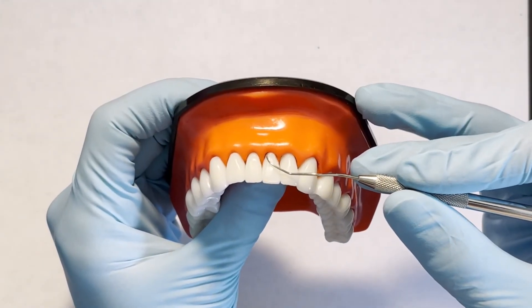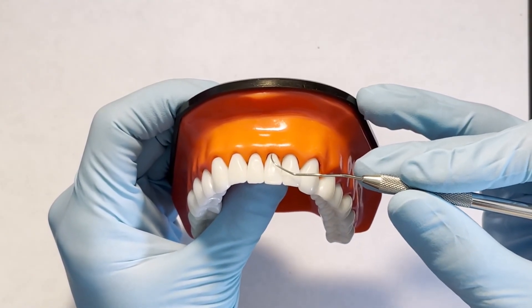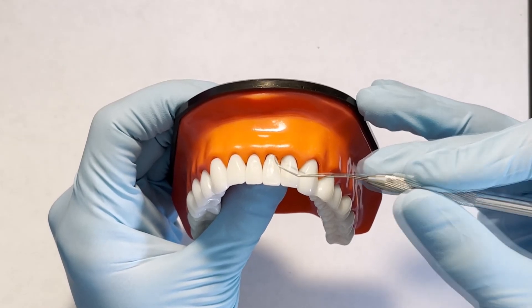At the midline of anterior teeth, a horizontal stroke can help ensure that nothing was missed when transitioning from surfaces towards and away.